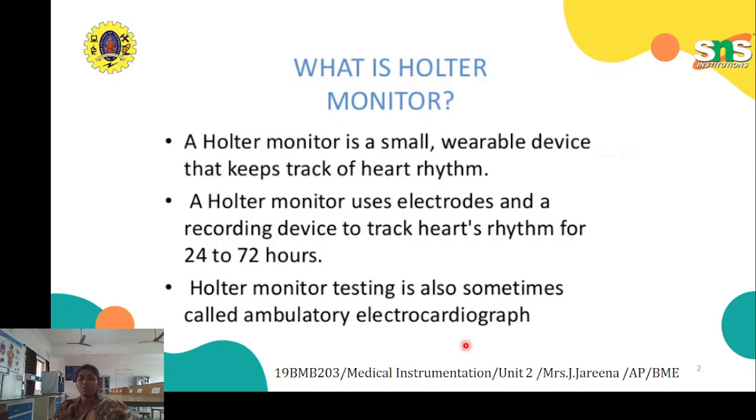Here too, we have a set of electrodes that we place over the targeted area where we want to sense the heart's rhythm activity, and then we have a monitor to display the ECG signal. The difference is that with the Holter monitor we can have continuous recording, whereas with ECG we have event records.